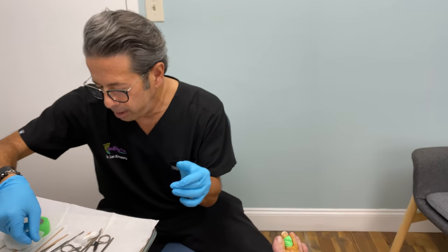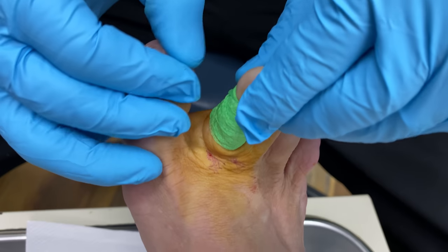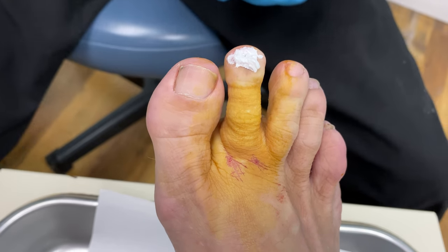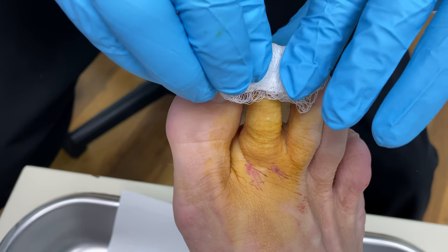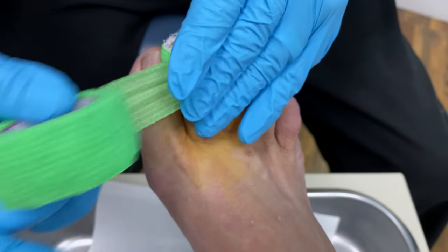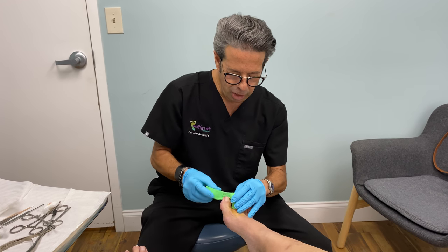Nail's gone — we're going to wrap her up. We haven't shown the wrapping in a while, so let's take this off of her. Let me find my leading edge here. So we're going to unwrap it and then put some Silvadene cream. You can see there wasn't much bleeding there. She'll take this off tomorrow — she's going to clean it with soap and water and a washcloth, or she can take a Q-tip to get in there and scrub the nail bed with some soap on it, then puts some Neosporin and a Band-Aid. She does not need to do a big wrapping like this, but she can put gauze around it if she wants to wear closed-in shoes for work — she'll put the gauze for padding, and then she can do anything she wants.